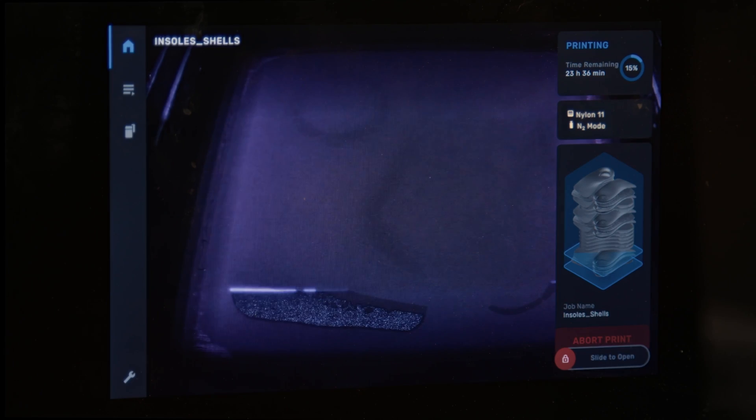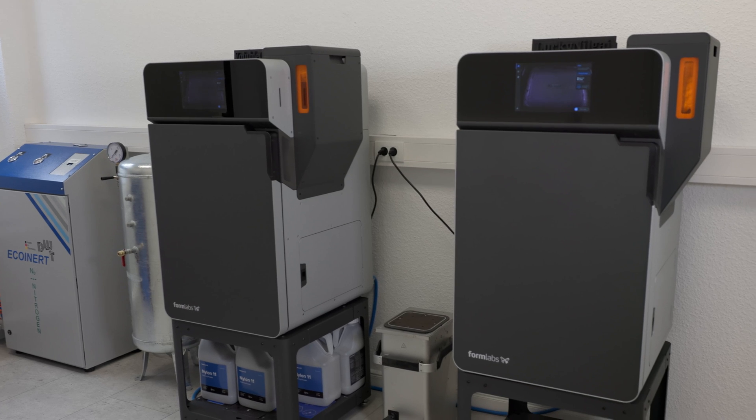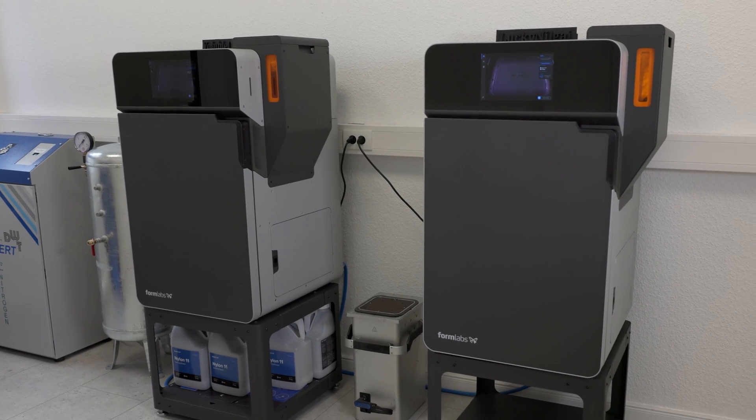With the Fuse 1 Plus 30 Watt, you'll be able to begin printing insole shells within 24 hours of delivery and maintain reliable uptime thereafter. No other 3D printer on the market can do that.